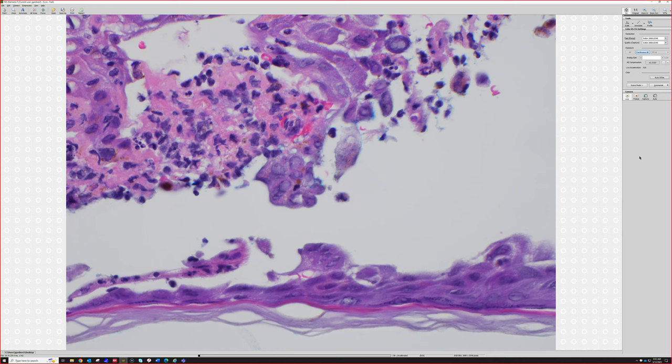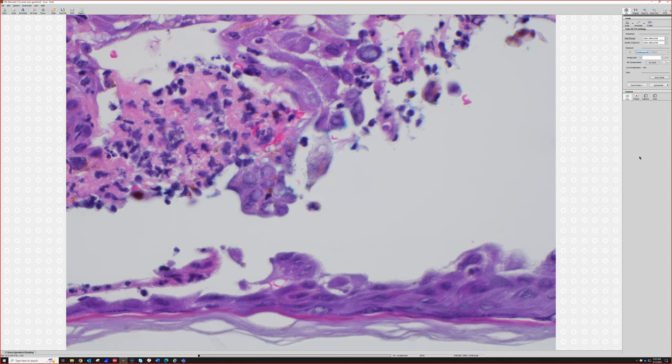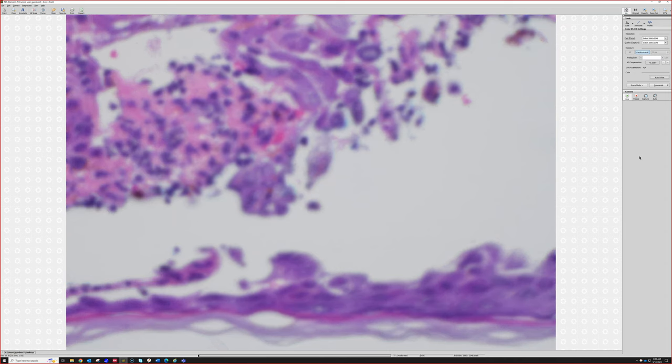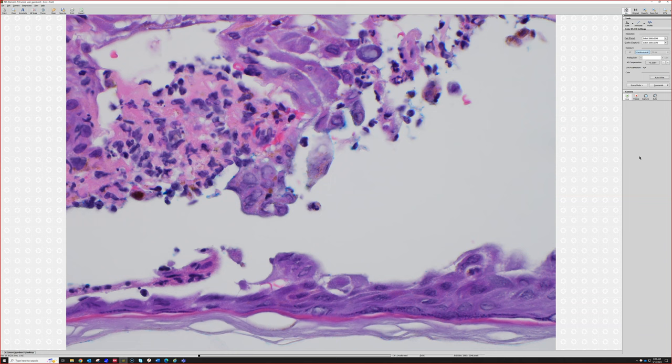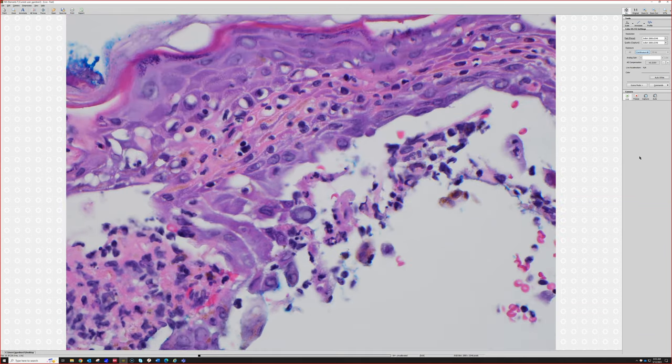I didn't give you any clinical here, which is unfair. So this was on the penis. And it was painful, blisters with erythema and erosion and ulceration, right? But you are right, and I think it's a great point that if all you learn about herpes is what herpes cytopathic effect looks like, you're going to miss some herpes, because sometimes the cytopathic effect is very focal or even absent on a given section.